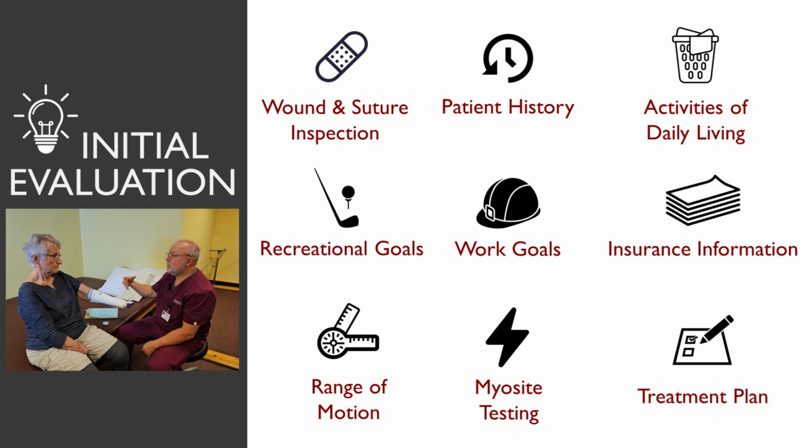I mentioned early in that slide that sometimes we're seeing these patients for the evaluation prior to surgery. In those cases, that's great because then we can sometimes work again alongside the doctor and the therapist and determine what does the patient present as and what are the options for amputation in terms of the location of where that amputation takes place, because that can completely change the landscape of what prosthetic care and treatment mean for them.